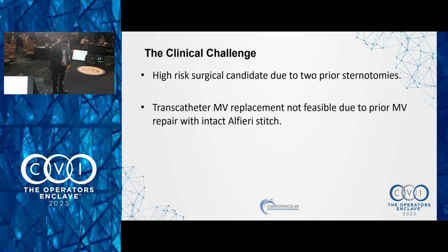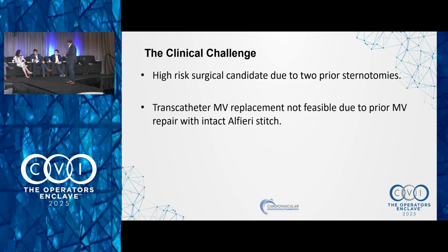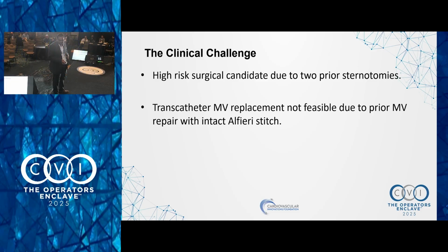Actually, we've done about 10 of these, not these, but plugs with clips. And actually, I find the commissural the easiest. What we do is a 3D sizing, and we go with the largest size. Usually it's a 16 or an 18 plug. But follow-up is not the best. I just saw a patient 3 years out who now has a leak around the plug, which is unusual. But in this case, if the gradient is fine, I would size it on CT or 3D and try to put a big plug in the commissure and see what happens.